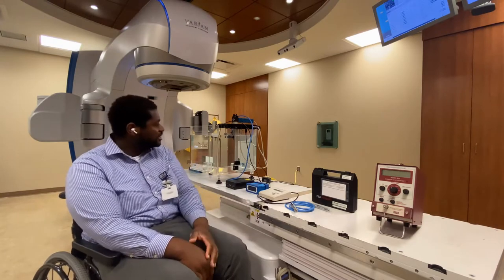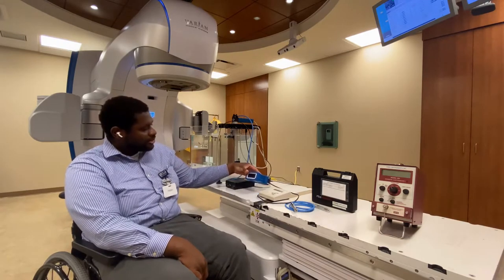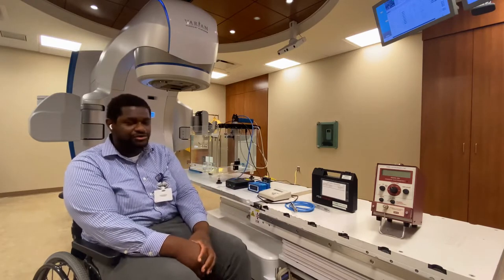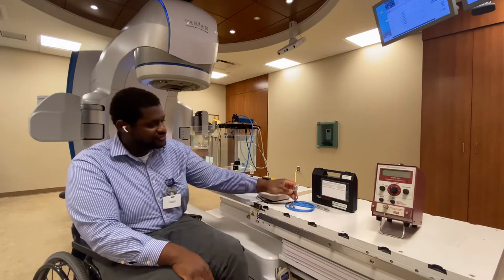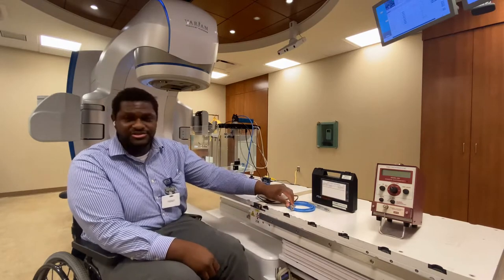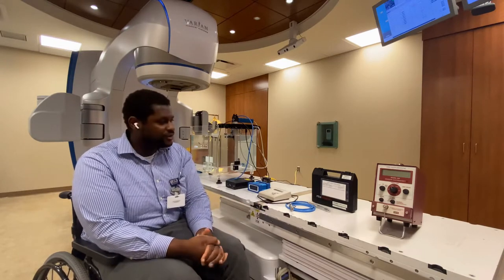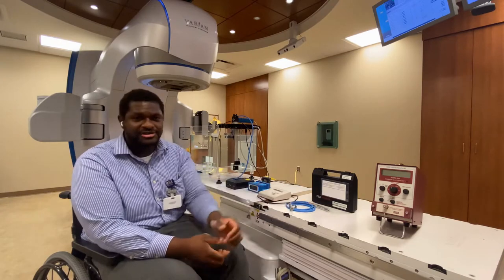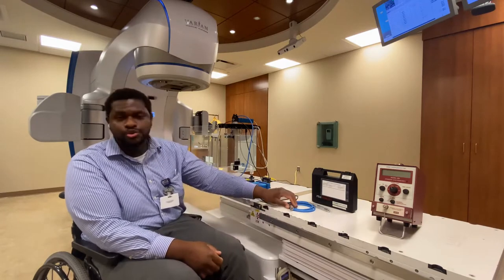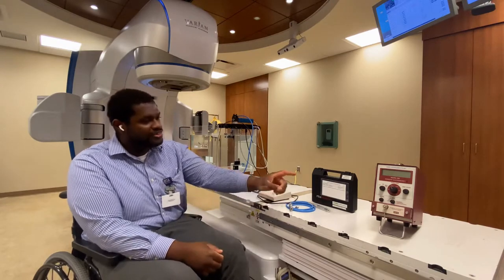So this is the equipment that we're going to be using. We have our IBA tank which is currently filled with water. We have our barometer which also will be measuring our temperature and pressure for our temperature and pressure correction factors. We have our TG51 ionization chamber which is an N313 chamber, 0.6 cc's, and we also have our electrometer here. Now one thing to note, if your electrometer and your ion chamber are sent out as a unit, your P elect will be one. If not, then essentially you'll be using the P elect that is listed on your electrometer.